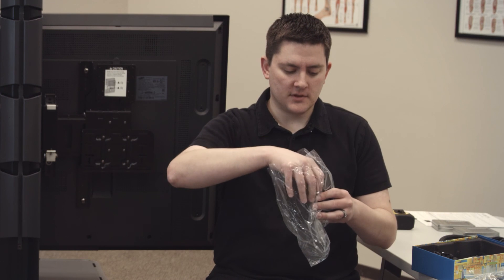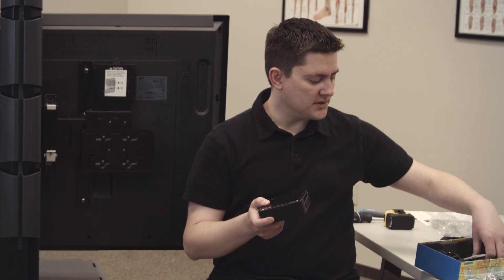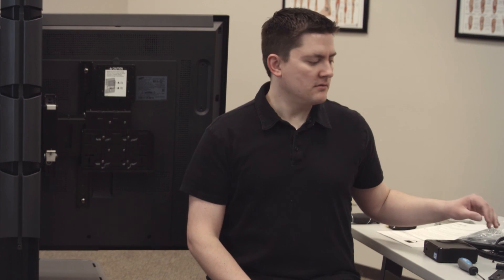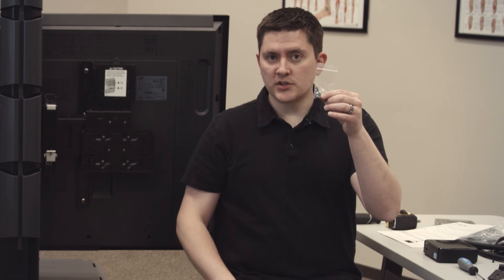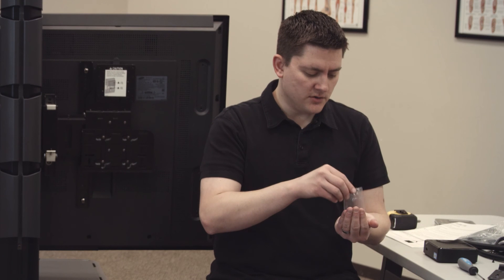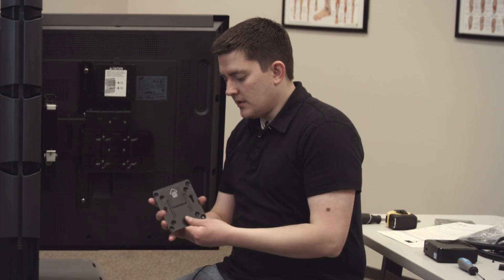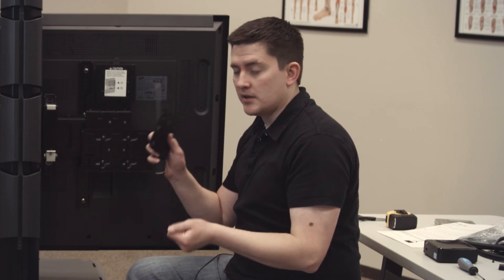Underneath the computer there are some manuals and a mounting plate that looks like this. I'm going to set the computer aside. Inside your Intel computer box you're going to have a little bag full of screws — there are four silver ones and two black ones, and we're going to start with the silver ones. We're going to use those to mount a mounting plate that came out of the Intel box right here. It has an arrow that says 'this way up,' and you're going to use a Phillips head screwdriver to attach it.